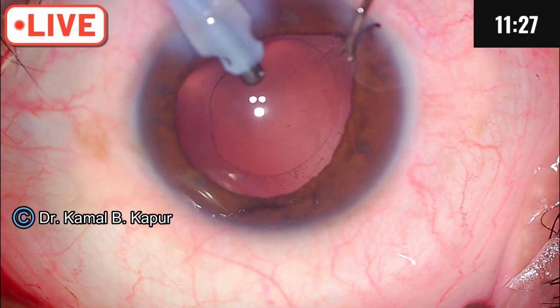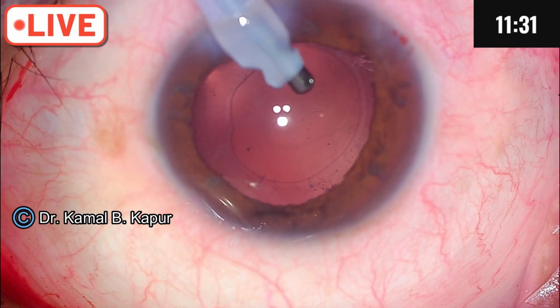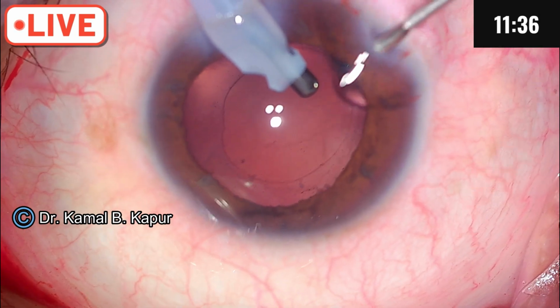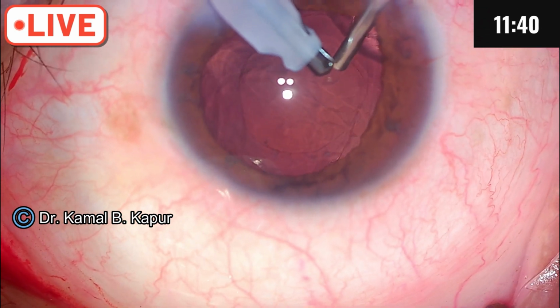Visco. Now before I remove my irrigation aspiration, I will do a visco exchange. Again, into the bag.